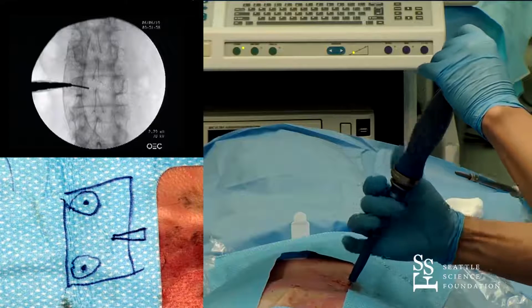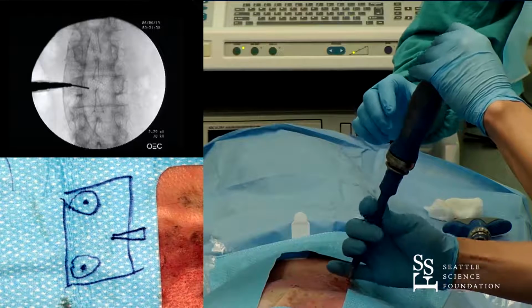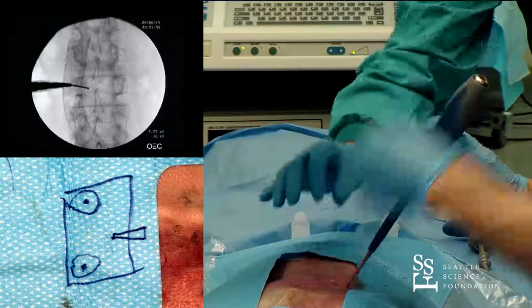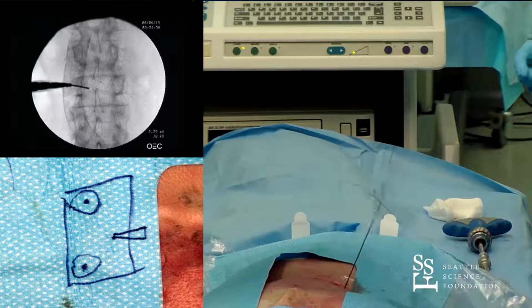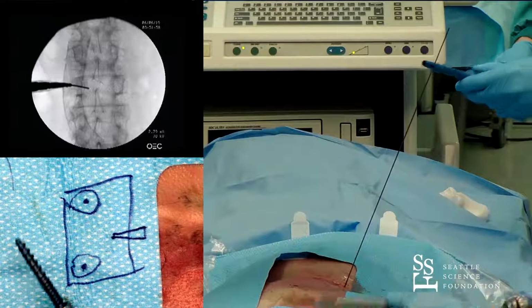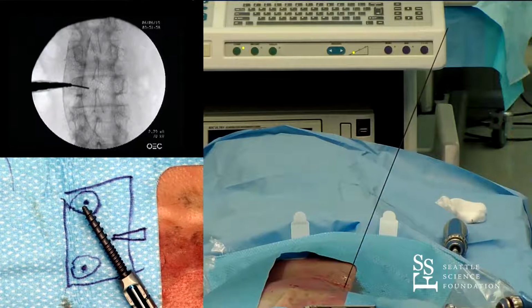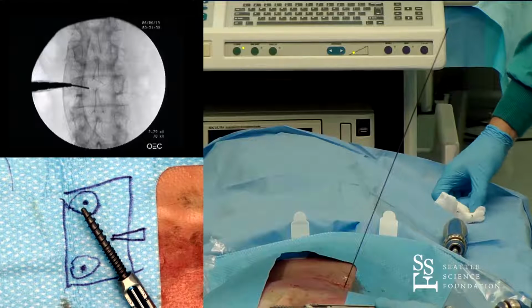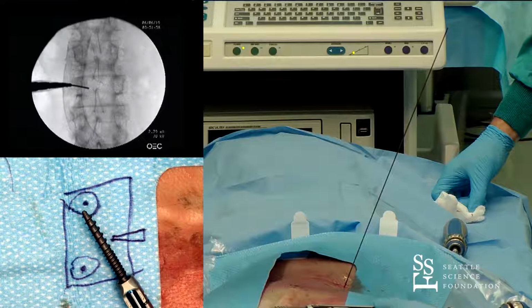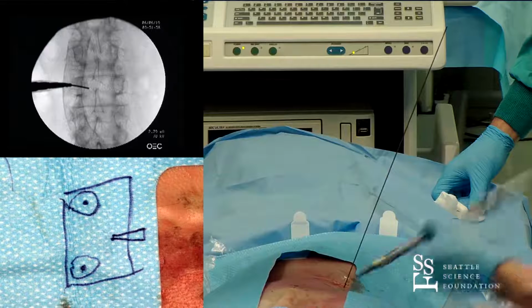I see how that's a very nice instrument. How are we doing? Almost, yeah. Okay, great. So here is the screw itself. That's called the pedicle screw, and we're going to be inserting that into the vertebral body past the neural canal, over a guide wire. This is called percutaneous fixation. You see that we didn't make big incisions. We're basically doing this with image guidance.